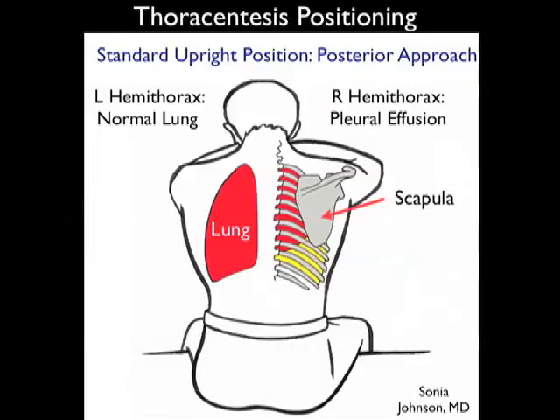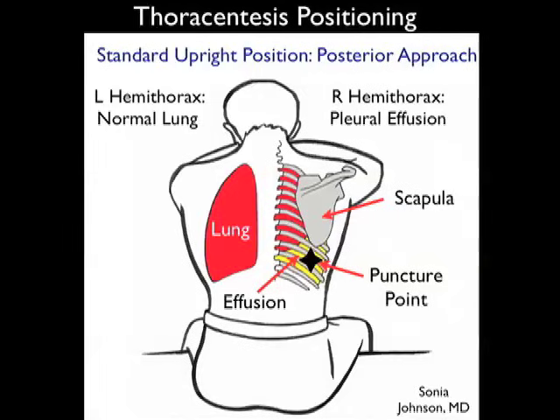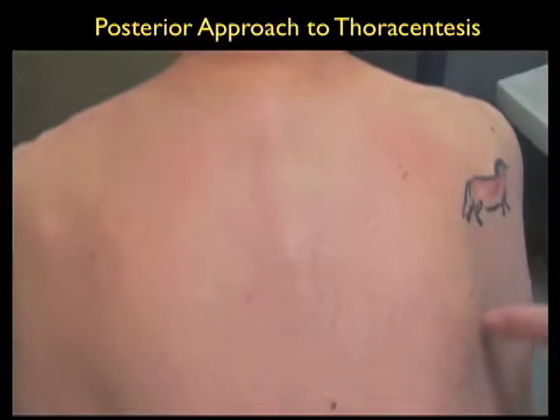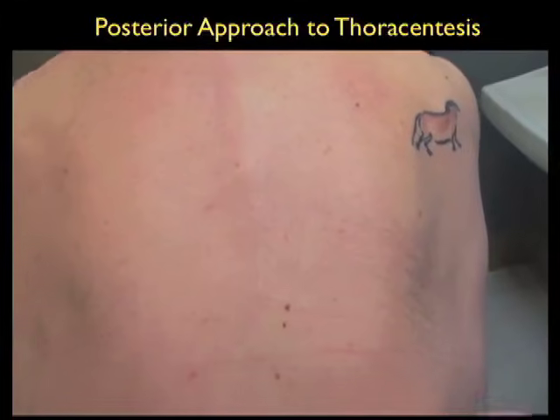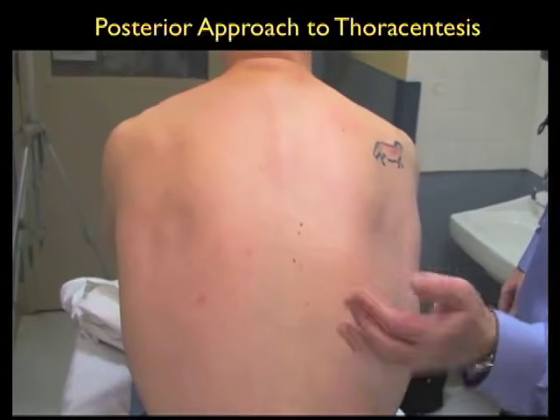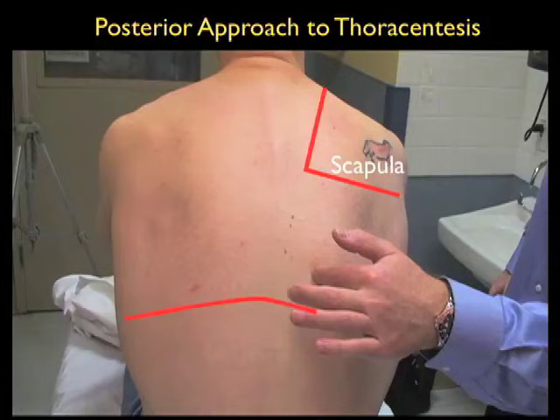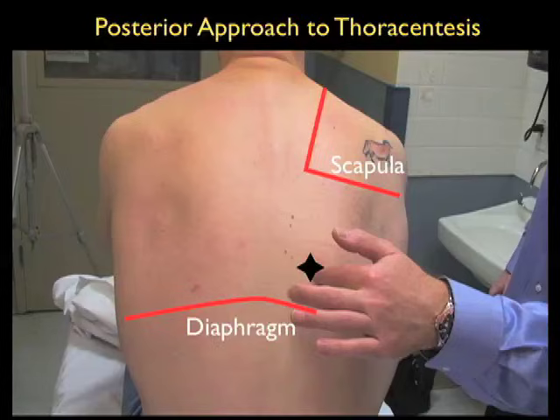Here we note the second traditional positioning of the patient for the thoracentesis procedure, which is the standard upright position in which the needle would come in from a posterior approach, with the patient bending forward over a stand or table. Here we see a pleural effusion within the right chest, with a puncture point that would come in below the scapula but above the level of the diaphragm. In this video clip I'll outline some of the surface anatomy important for the posterior approach. Here's about the level of the scapula on the posterior chest wall and this is about the level of the diaphragm, so the appropriate positioning for the needle would be safely above the diaphragm so as not to puncture through it into the abdominal cavity.